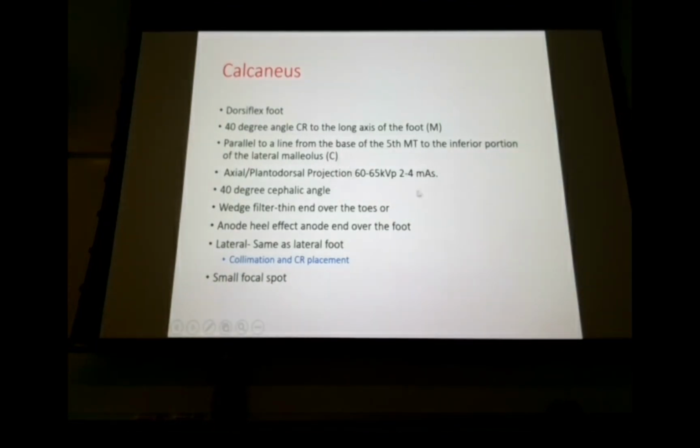The difficulty in teaching technique, and I think I've covered this before, is that I can tell you what I would shoot some person with based on my own anatomy, right? So you kind of memorize your technique based on what you would use on yourself, and then you adjust for the next person. My average person is going to be totally different than anybody else's, right? So teaching technique is something you just got to kind of pick up in clinicals.